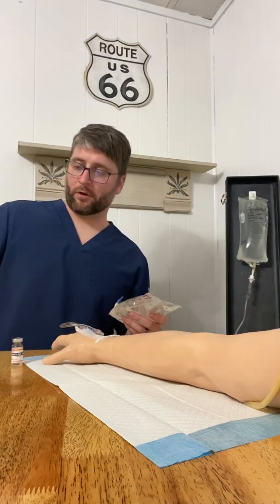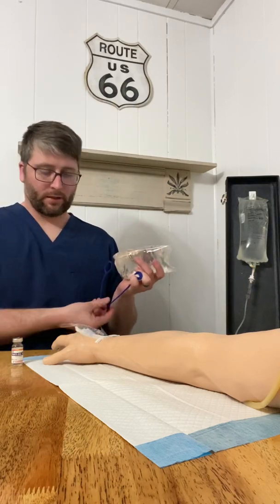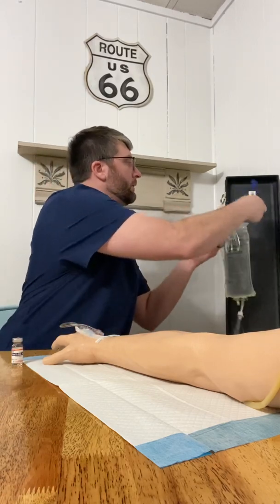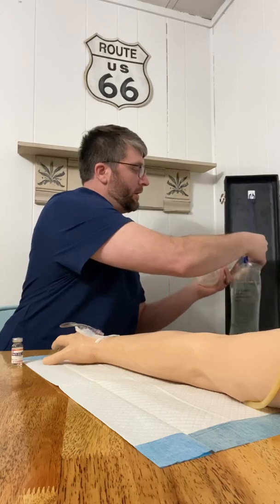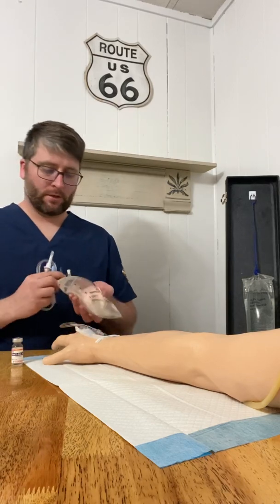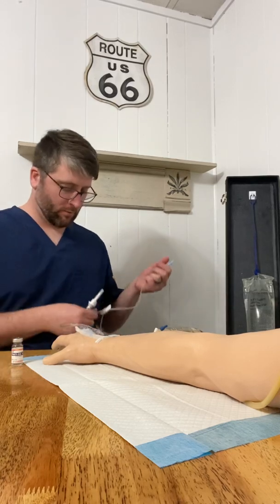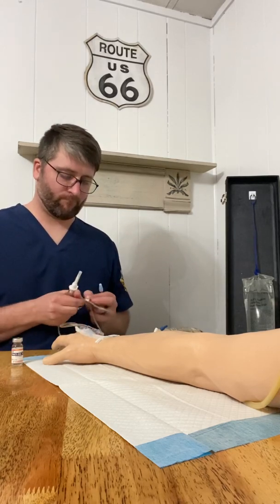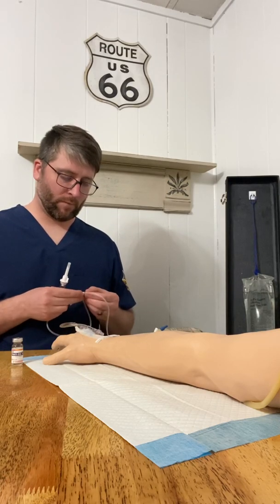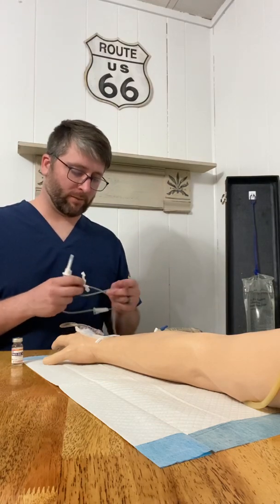All right, now we're going to open up our secondary IV tubing bag there. We are going to lower our mainline bag right there. We're going to open this up, set that down. Oh, and we got a knot. We got a really good knot. Thank you for bearing with me.